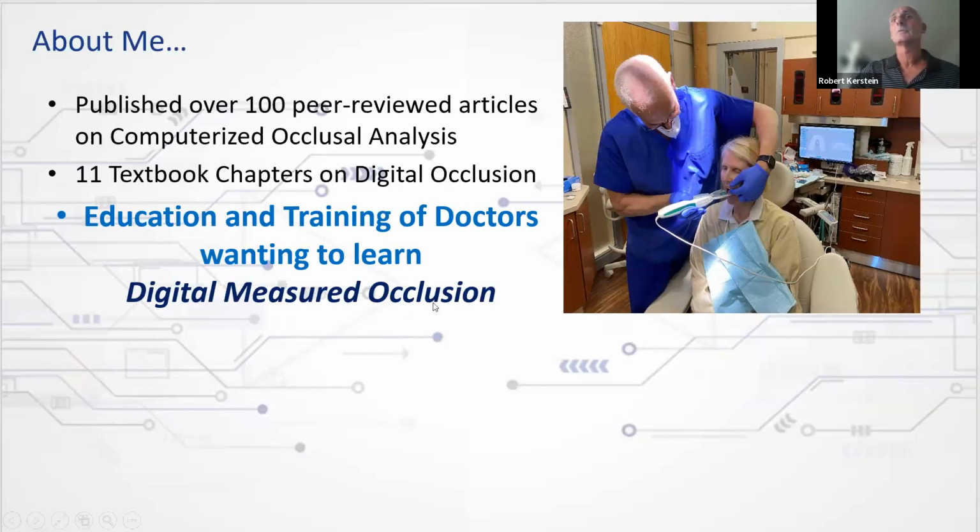The science of digital measured occlusion is a completely different animal than traditional occlusion, with wax and silicone and bite paper and guessing at the paper marks, and all the things that, if you have a T-scan, you're well aware of how different computerized occlusion really is.